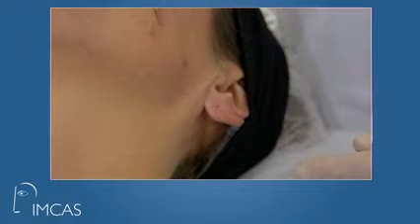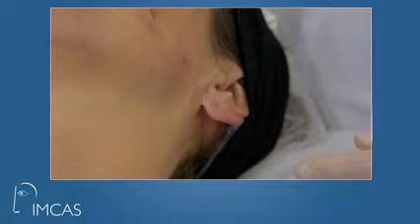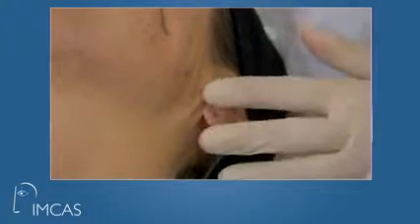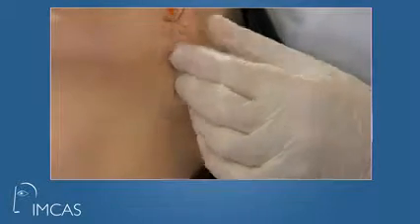And I am injecting the ultra deep on the bone in order to lift, you see, the sagging and to restore the loss of volume into the retromandibular triangle.